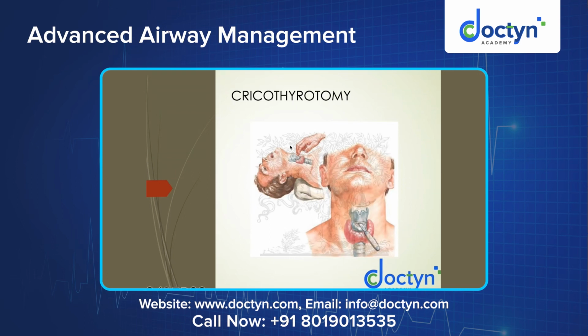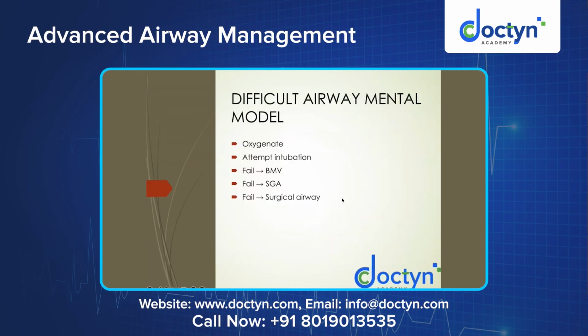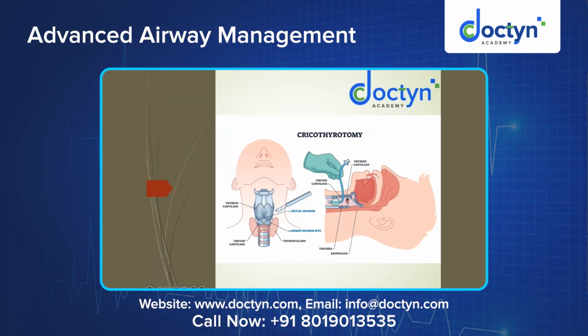See, you first palpate and identify, slit open the cricothyroid membrane, put a bougie, put an endotracheal tube across that and start ventilation. So initial incision, open it up, and put an endotracheal tube, or put a bougie and railroad the endotracheal tube across. Any which way you can do, depending on the size of the opening which is available there. And now you establish ventilation, because with this you go below the vocal cords, where there is laryngospasm. Below the vocal cords you have established the airway, you will be able to ventilate this patient.